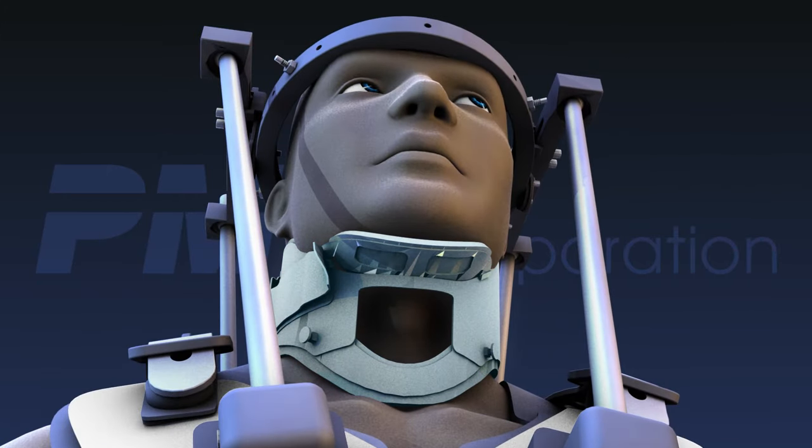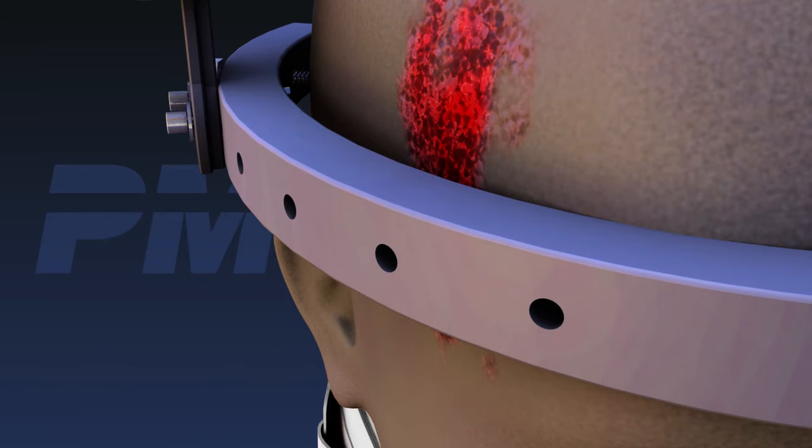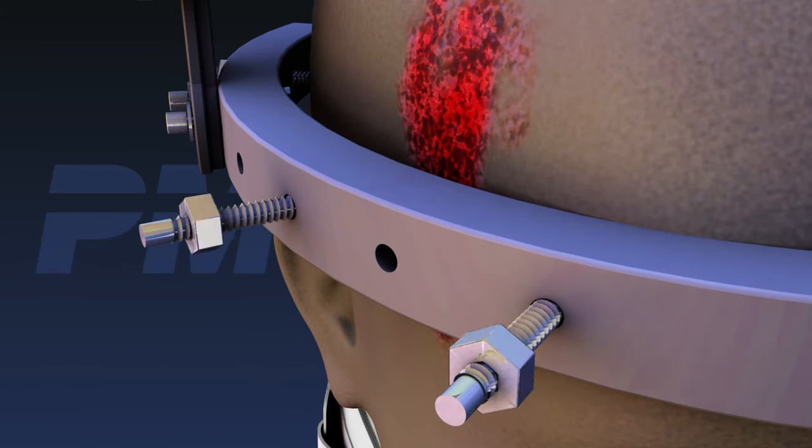Many physicians prefer to keep the collar on during the procedure to help stabilize the head and neck during application. If the patient suffers a skull fracture or laceration, place pins on either side of the injury.